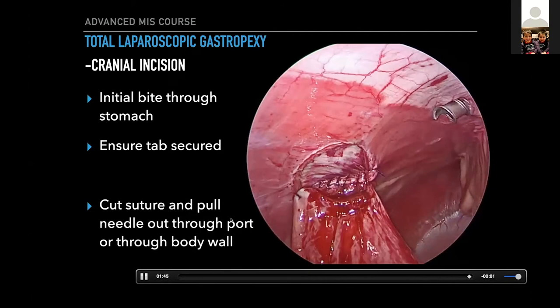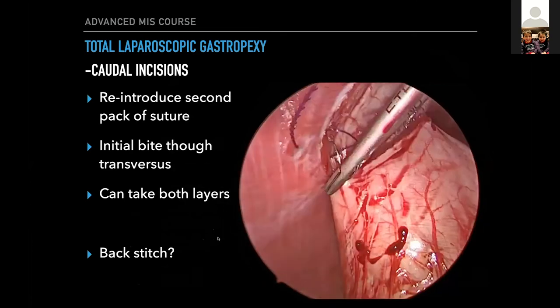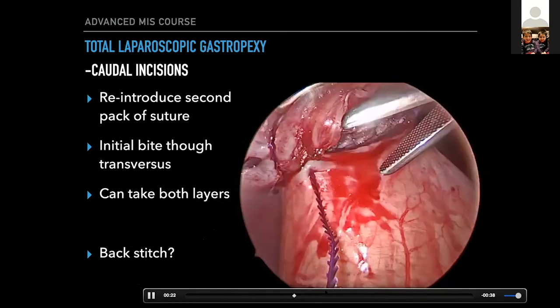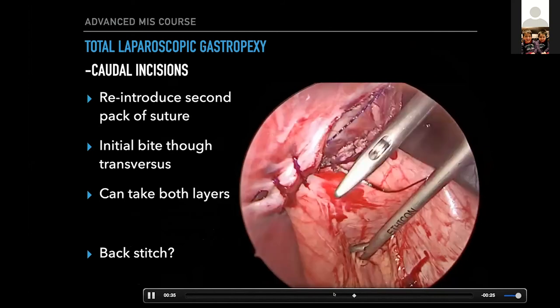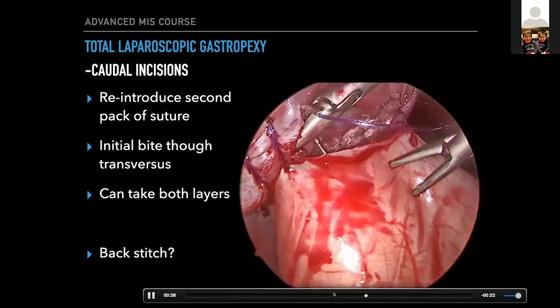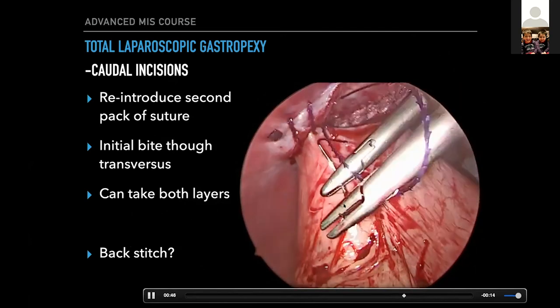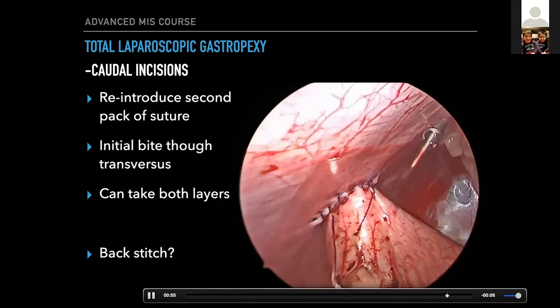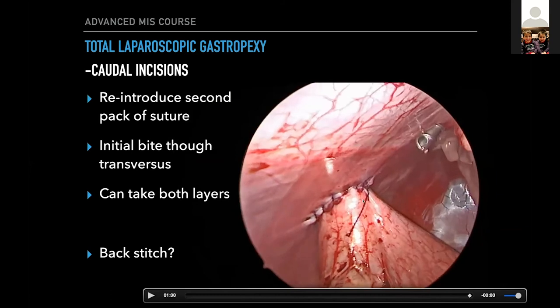That's the cranial incision done, then same thing with the caudal — nothing fancy. There are generally fewer bites in those caudal incisions. You really need to prioritize maintaining needle orientation — if you can do that, it will really reduce your surgery time. For those who have tried this, if you lose your needle orientation it takes minutes to reorient the needle, increases frustration significantly. There's our gastropexy completed. At this point I'll purge the pneumo, open the valves, get the gas out, and just watch the gastropexy — this is when it will be at its greatest tension.